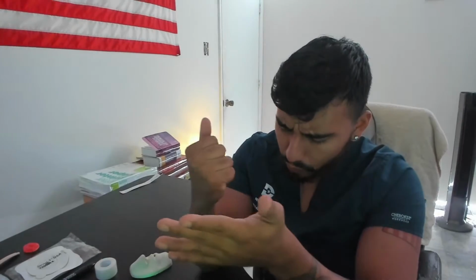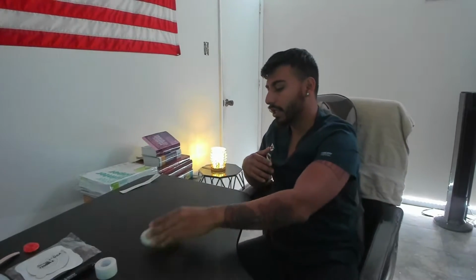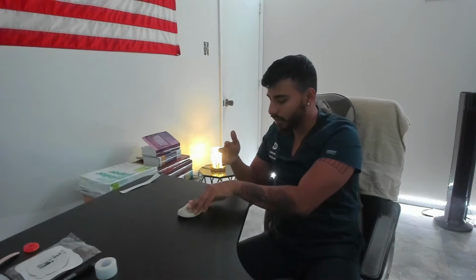I use warm water and soap, or adhesive remover, to clean the bridge of the nose of Mr. Buzzard, and then return the bed to its lowest position, rail back up, supine or semi-Fowler position, whatever the patient desires. I assess for additional needs, call light within reach, give my expected time of return, take off my gloves, perform hand hygiene, and document the date, the time, and the patient's response to the procedure.